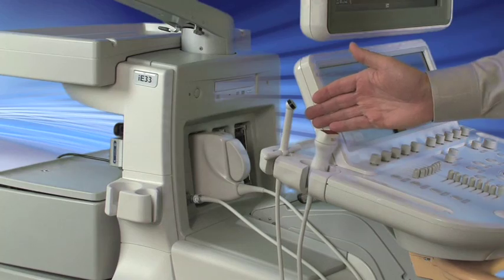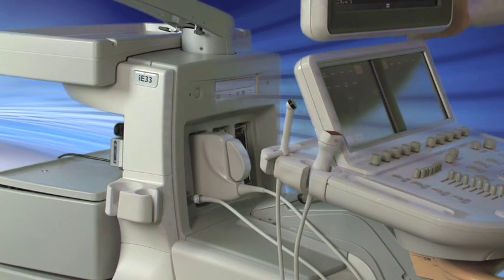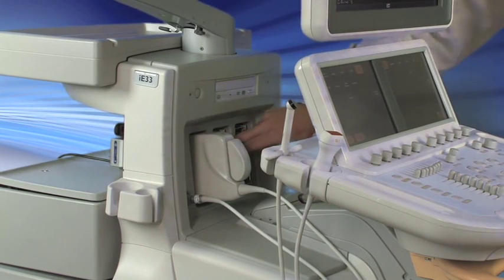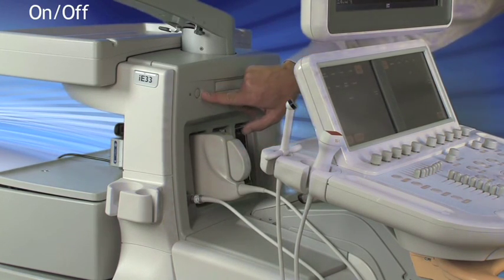There's transducer holders all around the instrument, and in the middle of the system is where you'll find the DVD player, recorder, and your transducer connectors. It holds three, and your CW connector, and the on-off button.